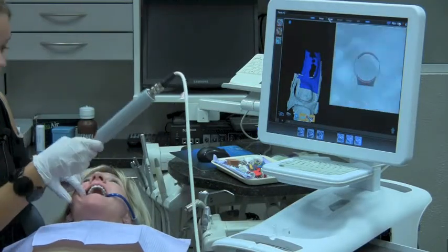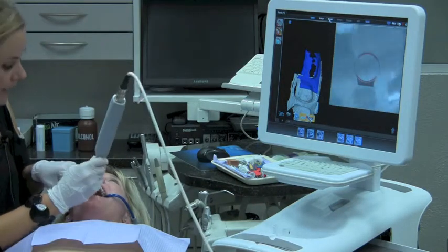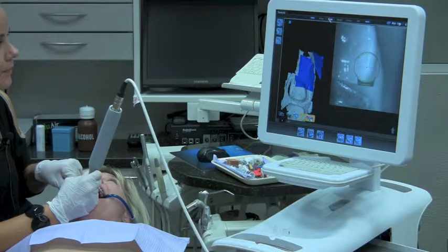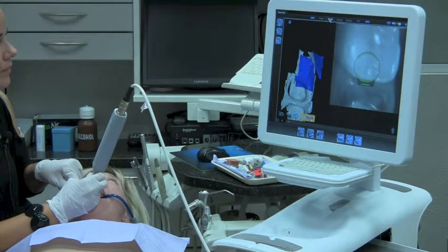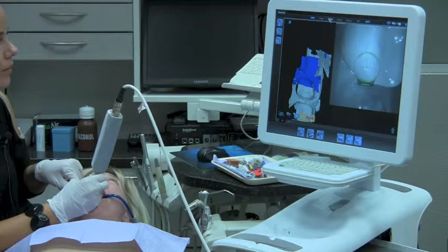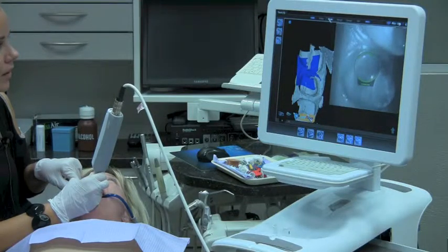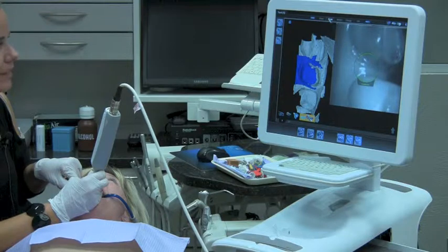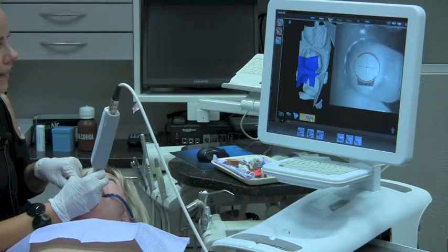Now I'm going to start my loop around because I need to capture the occlusal of the distal neighbor, plus I need to capture the lingual aspect. So I'm looping around to the lingual, and now the lingual interproximal on the distal, the lingual of the preparation, my mesial interproximal, and then my lingual of my neighbor.